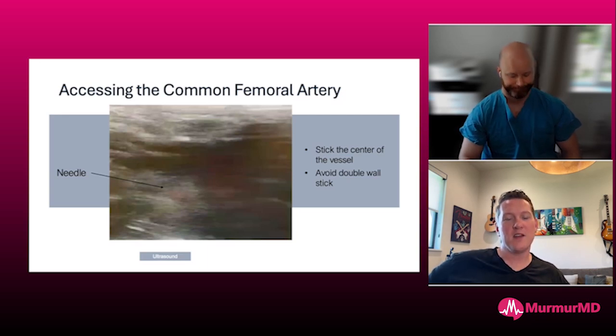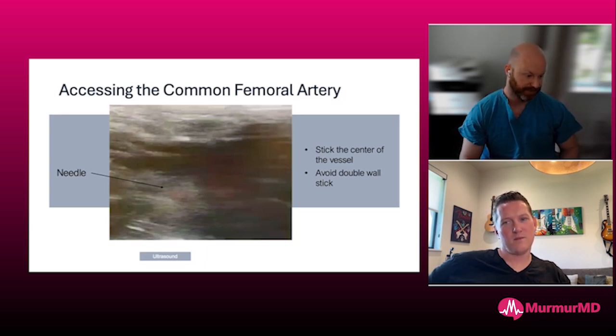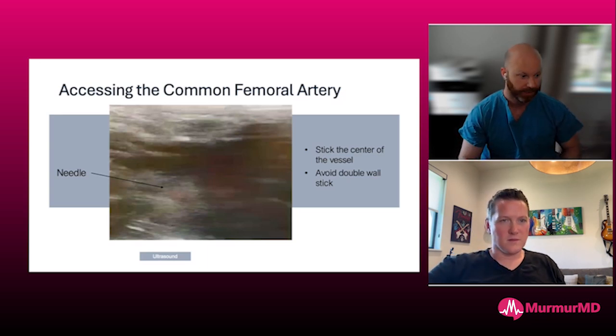I'd rather take 5 minutes and make sure it's right than just use the ultrasound as an artery finder, and I get flashback. I'm like, all right, we're good. Exactly. And actually, to your point, that's one thing that concerns me sometimes. I'll be trying to find my needle, and then I'll look down and I do have flash, and I'm like, well, where is my needle? I'm moving my ultrasound, trying to make sure I'm holding it right where I want. I'm trying to angle exactly where I want to stick. I've clearly stuck below where I wanted to now, because I didn't get to see it enter the arteriotomy.